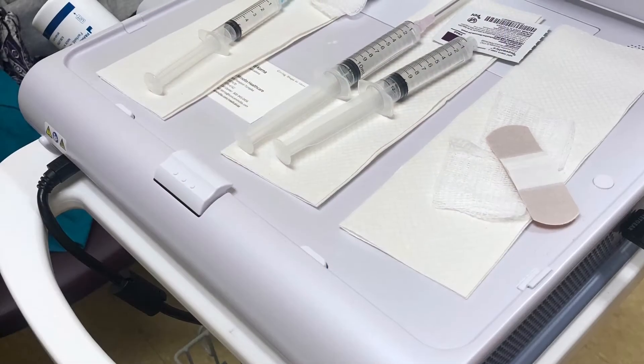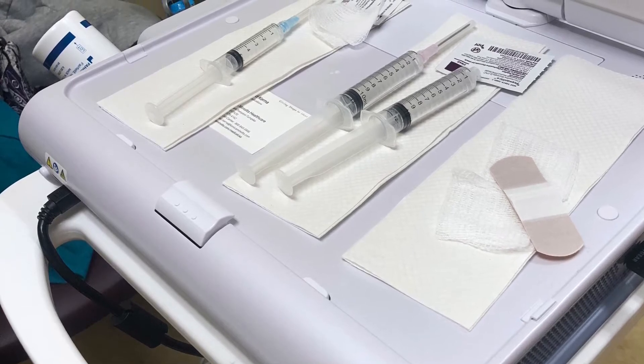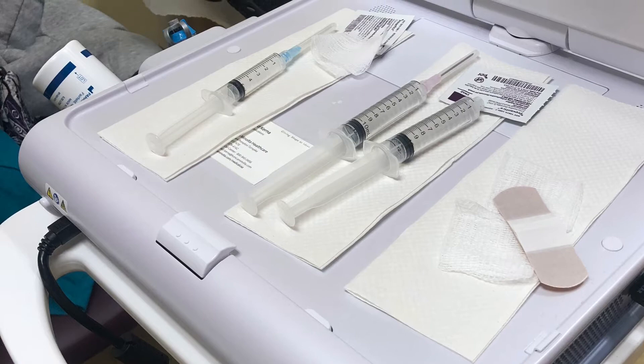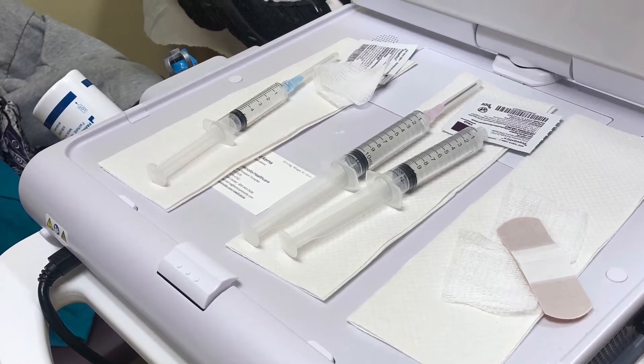Hi, this is Dr. Marc Carrieri and today we're going to go over a barbitage procedure for a calcific tendonitis of the shoulder. Here we have our setup. You can see the ultrasound machine. We have a syringe with lidocaine for numbing and two syringes with saline for breaking up the calcium deposit.